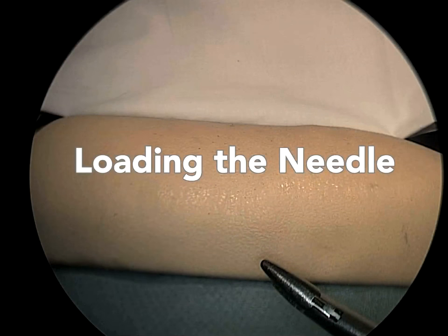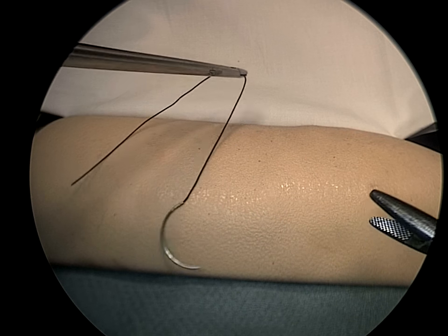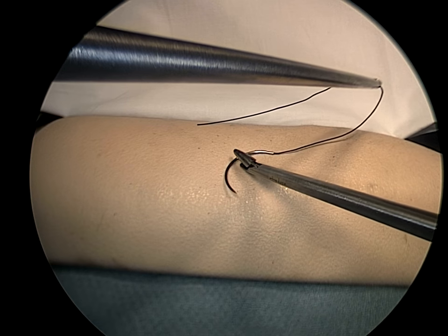In this first sequence, loading the needle at its mid-arc is accomplished easily by the principle that a curved needle will follow a curve.